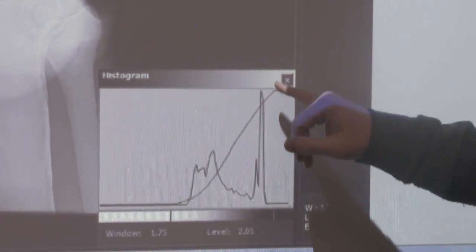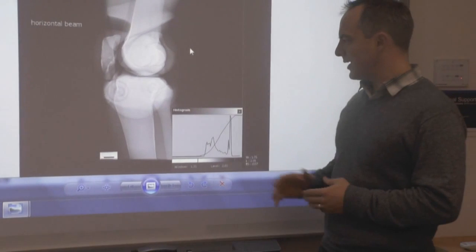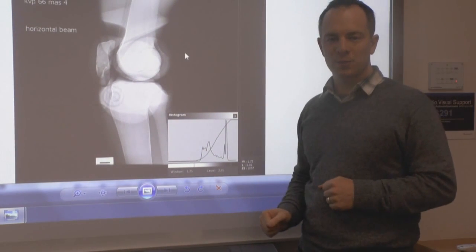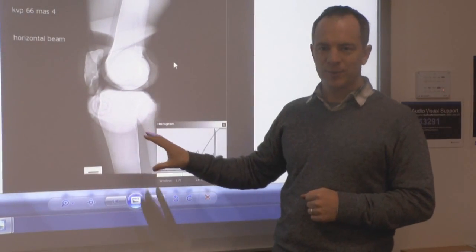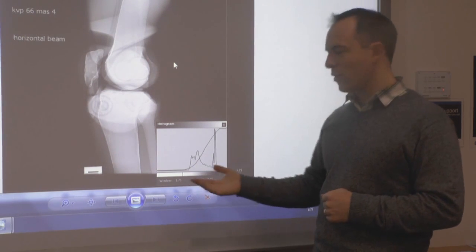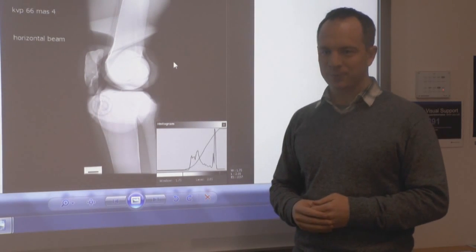So we can see here that there's a lot of bright values, but also a lot of dark values in the image as well. To calculate the exposure index, we normally throw away areas where it's overexposed or underexposed, and just focus on the main levels of grey scale that are in the image. And we calculate the median of this histogram in order to then go on using some algorithm specified by the manufacturer to calculate the exposure index like this.